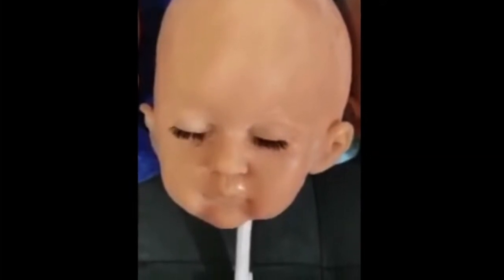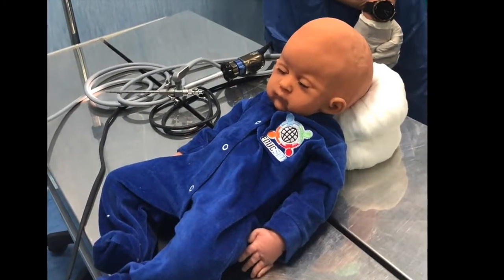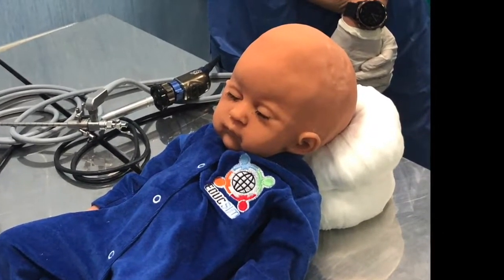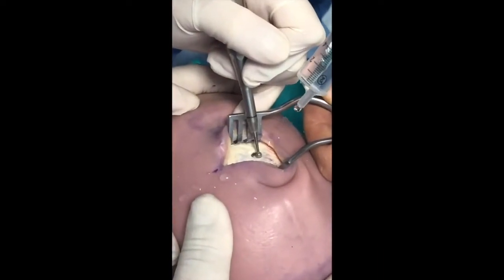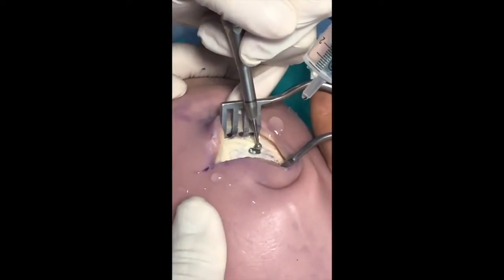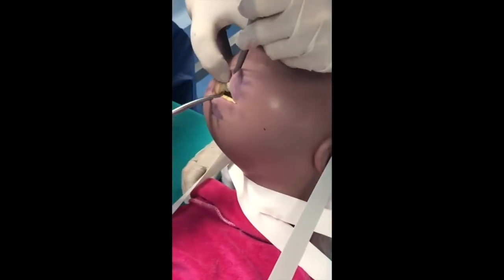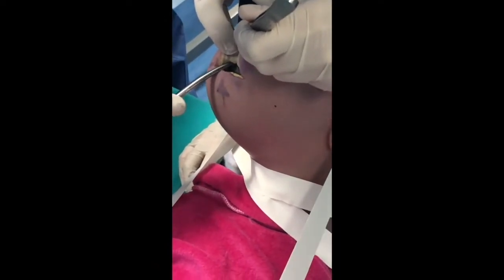The training module is then connected to the puppet's infant body by a simulated cervical spine, of acrylic composition. In this way, the head is locked by a simple acrylic connection. Using this model, training is performed as if it was a real operation on a real infant. The model is commercially available and can be used for training on hands-on courses and in the regular neurosurgical residency curriculum.